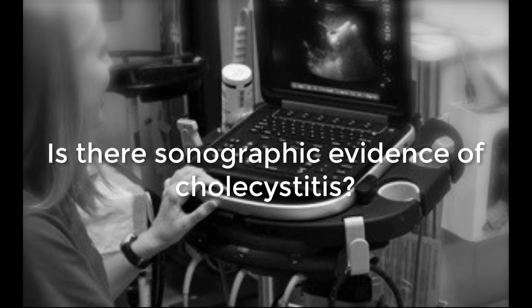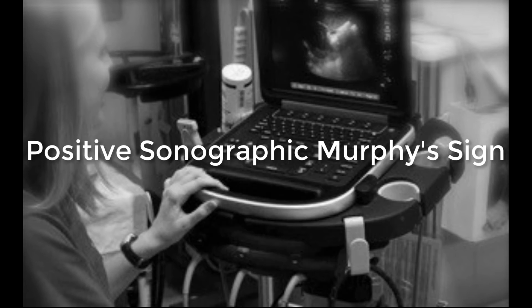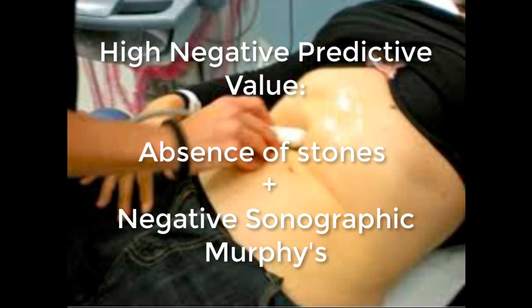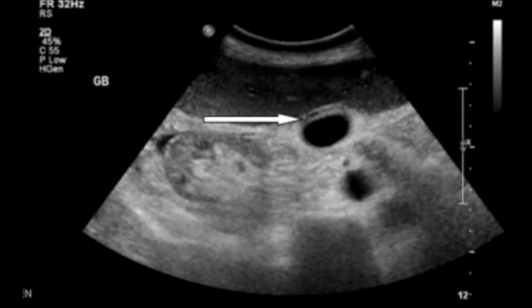Moving on to the second binary question, are there signs suggestive of acute cholecystitis? The 4 signs include a positive sonographic Murphy's sign, gallbladder wall thickening, pericholecystic fluid, and gallbladder distension. A positive sonographic Murphy's sign is elicited when the patient experiences maximal pain while probe pressure is applied directly over the gallbladder fundus. Note that the absence of stones and a negative sonographic Murphy's has a high negative predictive value for cholecystitis.